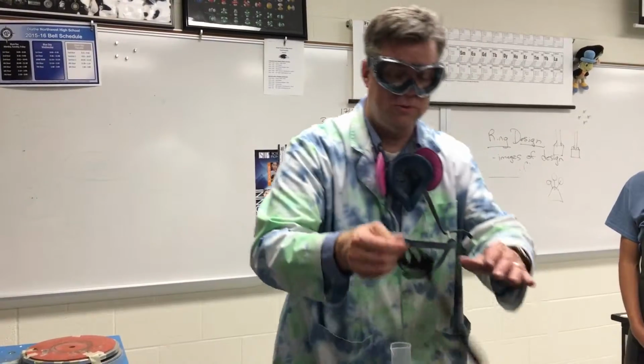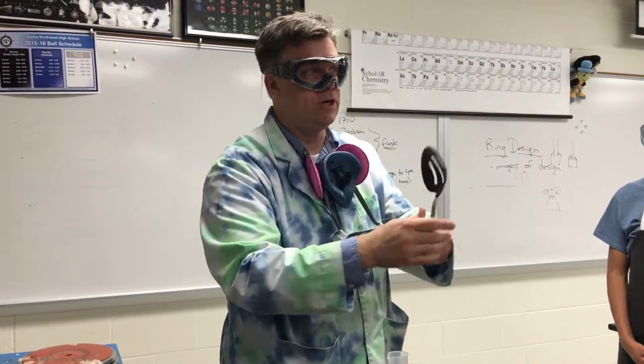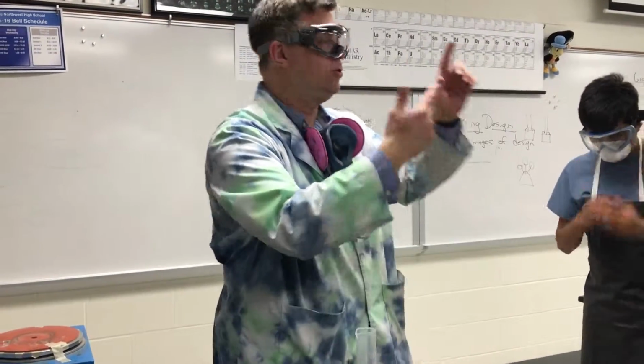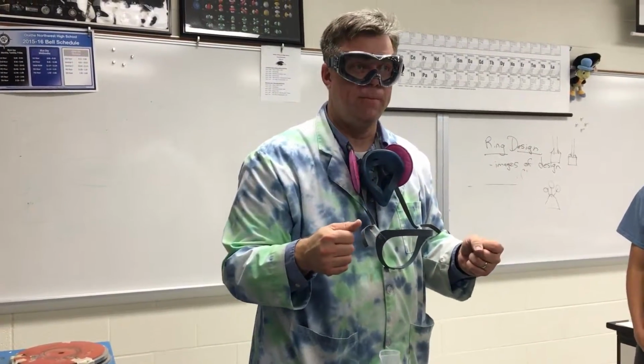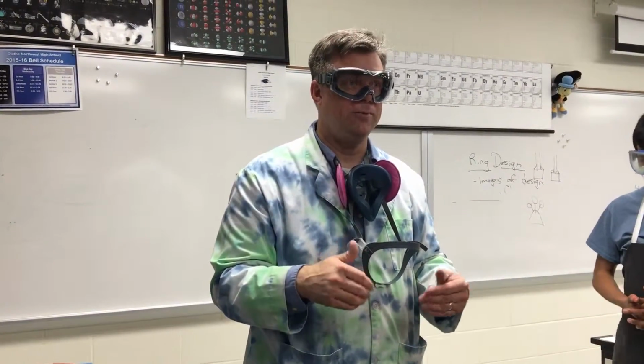And on the spoons, look in these little crooks and crannies to make sure all of that is out before you start, because you don't want any investment in there. Once this is done, you clean it up, and you'll go to the next group that's 3 down from you, or you're getting it set up here ready for the next group for next hour. Okay, so be sure you're doing the cleanup, and again, we're going one after the other. Okay? Let's go.